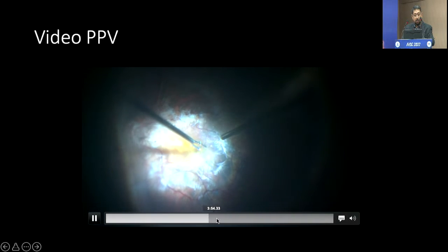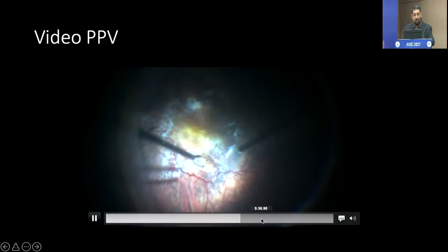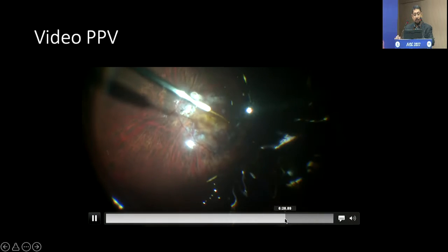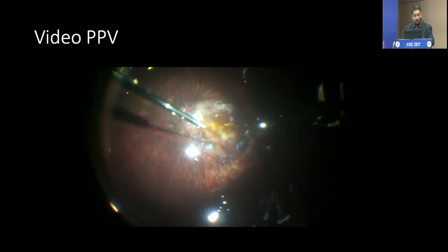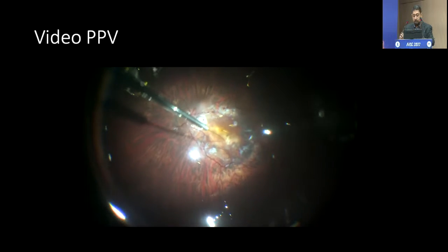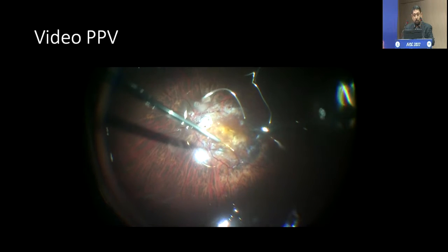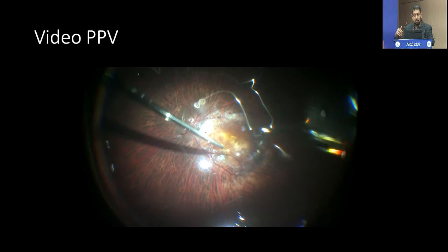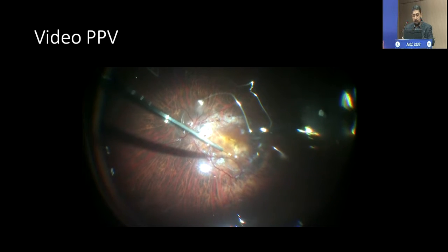And then there was a lot of residual fluid, and then we used a very nice instrument called Thomas cannula, large fluted with 39 gauge cannula, which can just penetrate and pull the fluid off the posterior pole to make it flat. Otherwise, you can imagine if you do a tamponade, the fluid is not going to escape because it's lying within the staphyloma like a cup.